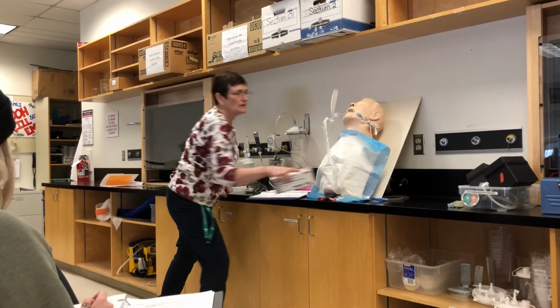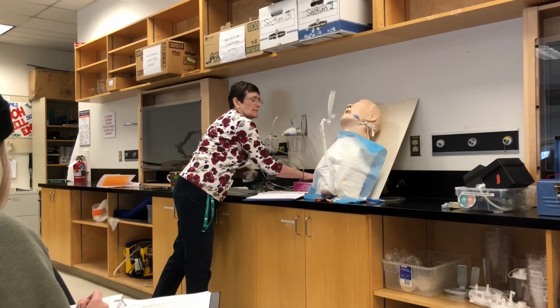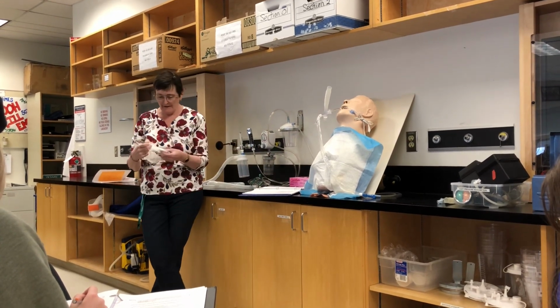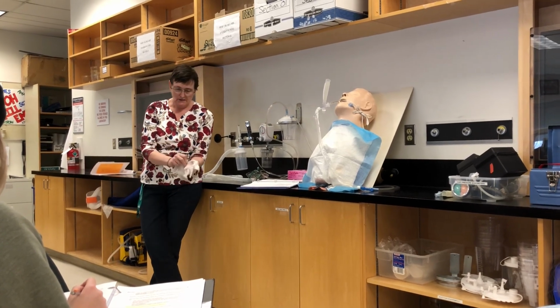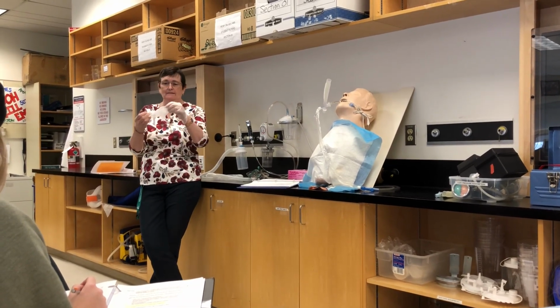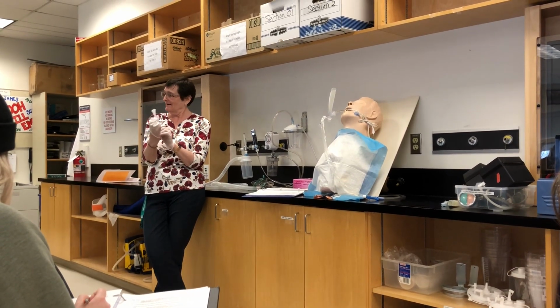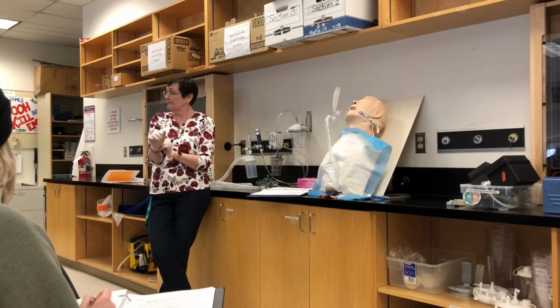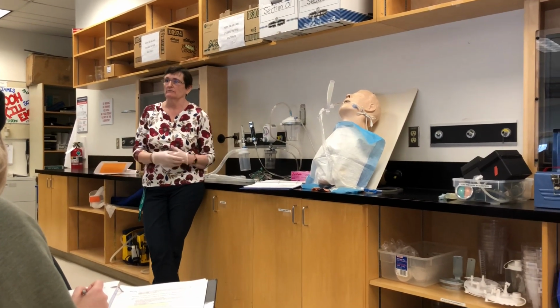Don't need the tongue depressors anymore. Okay, got some gloves on. Get my eye protection on because he's going to be coughing. And I would do what? Yes. Now what am I going to do? Talk to him? Yeah. Sure. You bet, absolutely. Tell the patient what you're going to do.